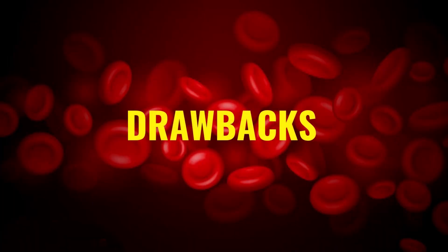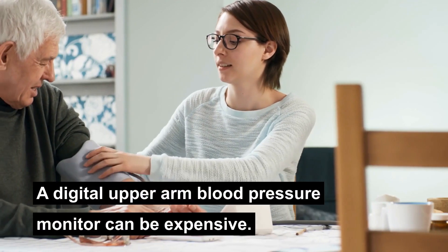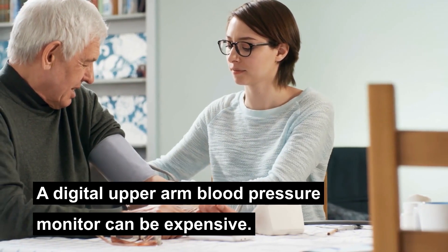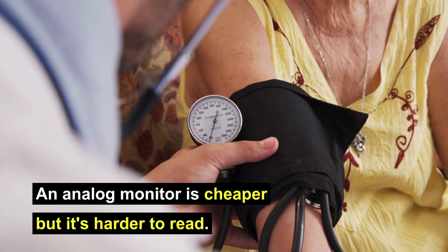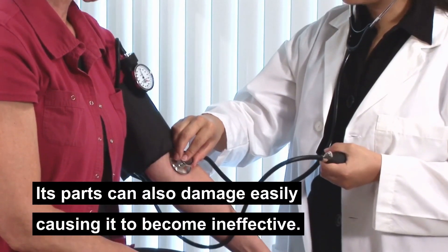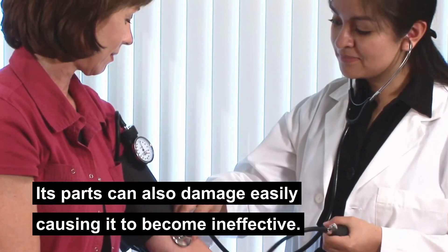What are some drawbacks? A digital upper arm blood pressure monitor can be expensive. An analog monitor is cheaper but it's harder to read. Its parts can also damage easily, causing it to become ineffective.